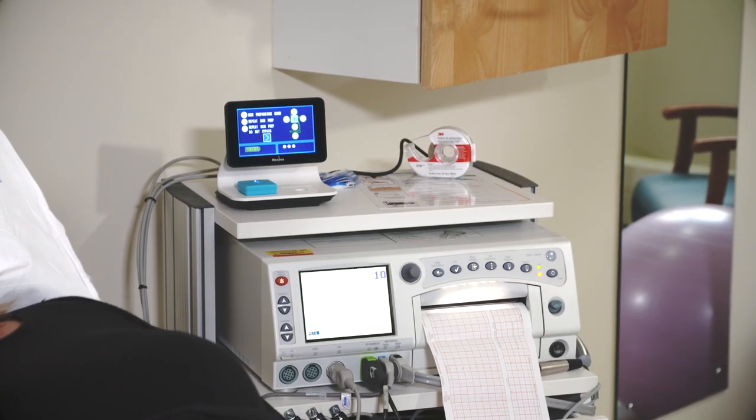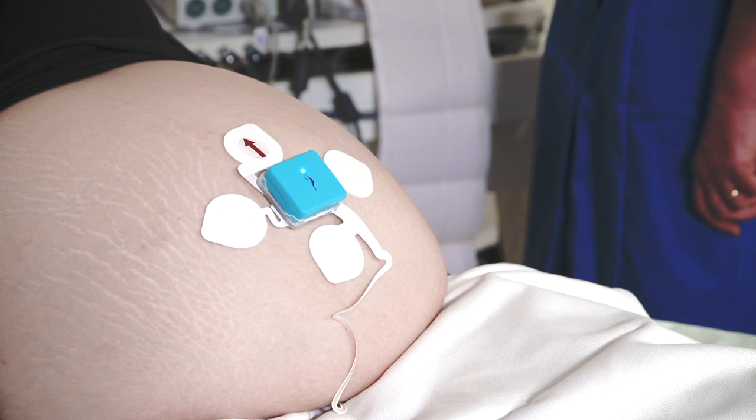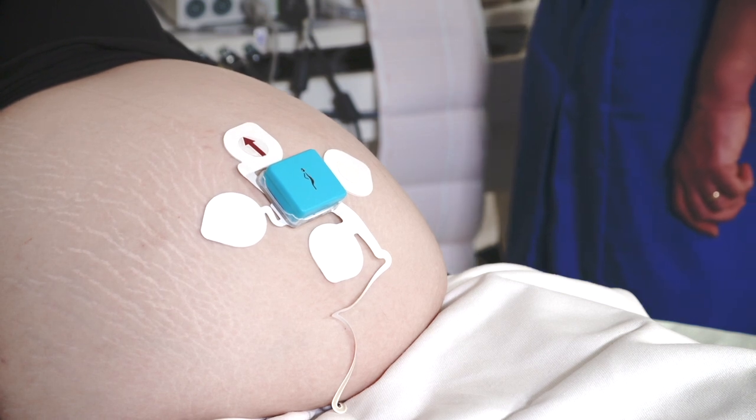As soon as the pod is located in the patch, the Novi display will change and show the skin electrode check screen, but if there are no problems, monitoring will commence automatically.